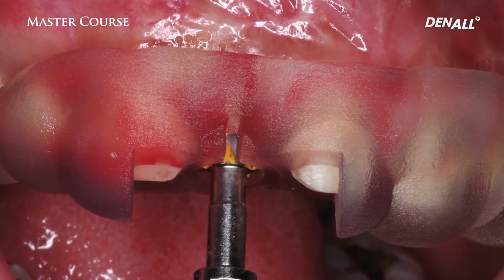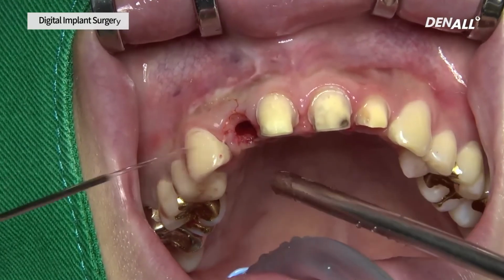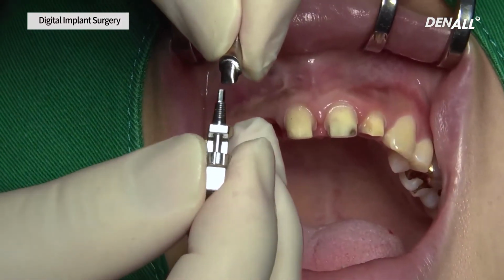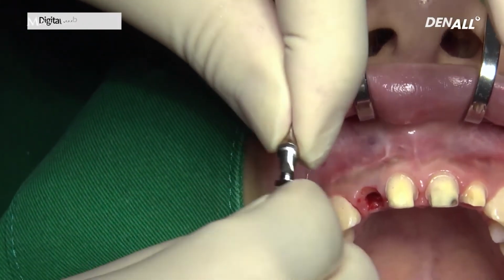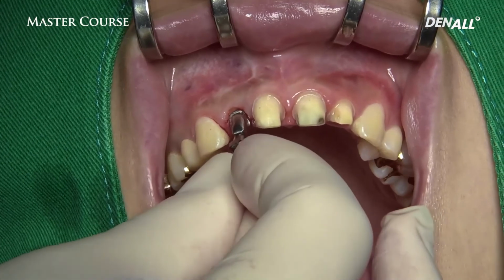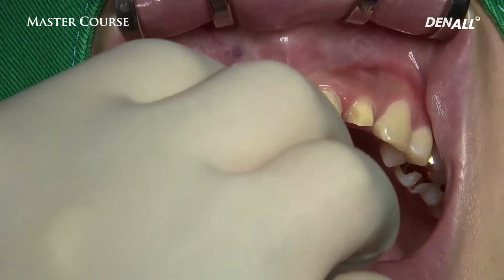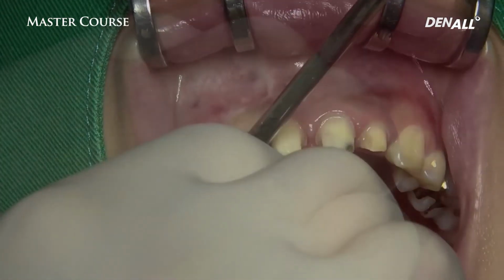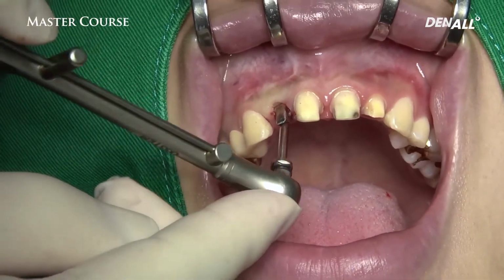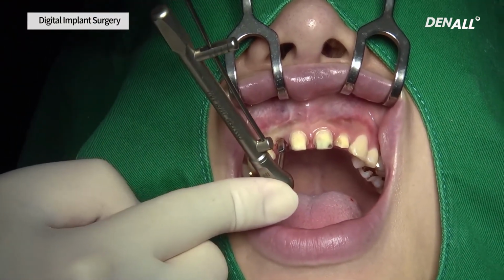That is very important. In this case, before implant placement, the customized titanium abutment, that is the OSSTEM One Guide abutment, and temporaries were fabricated in advance. A hex-type titanium customized abutment is prepared, so the hex positioning is very important when it comes to the internal connection type. When the abutment is accurately connected, the subgingival critical contour of the abutment presses down the marginal gingiva appropriately, automatically performing the tissue molding.